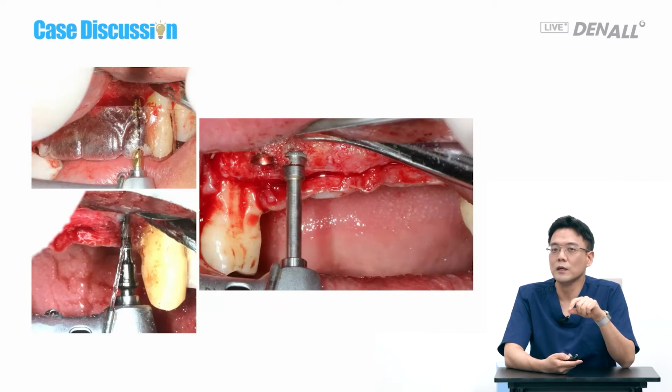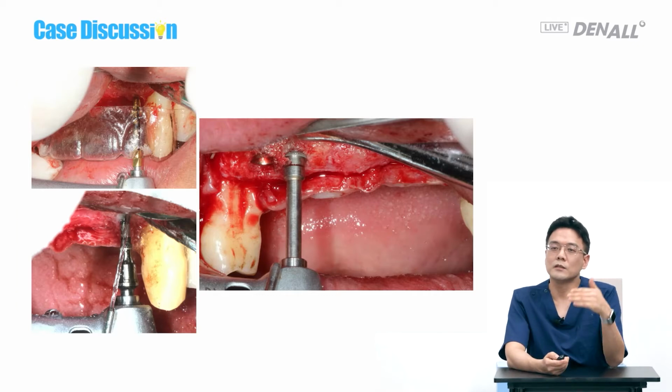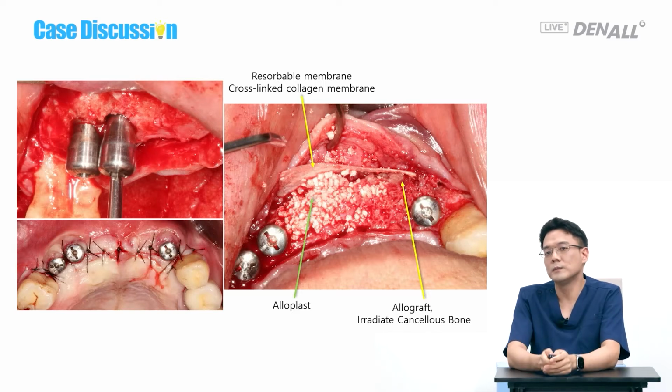So it would be hard to fill the gap that much. Implants are placed because there is available bone for the placement. So it is labially placed at 3 to 2 locations, and the bone graft is done again additionally to augment horizontally more.